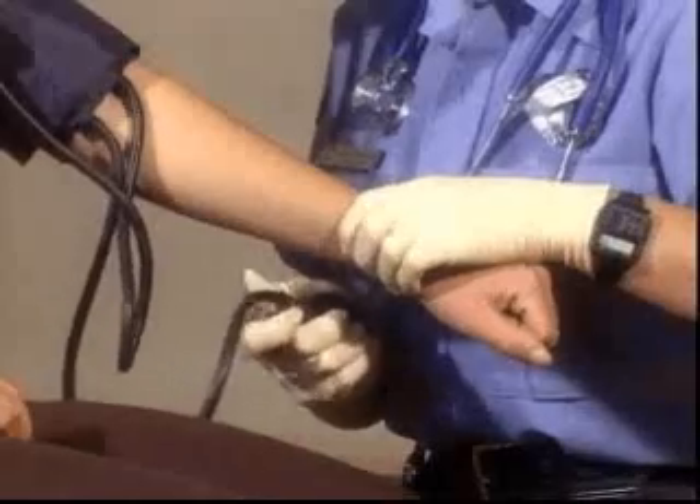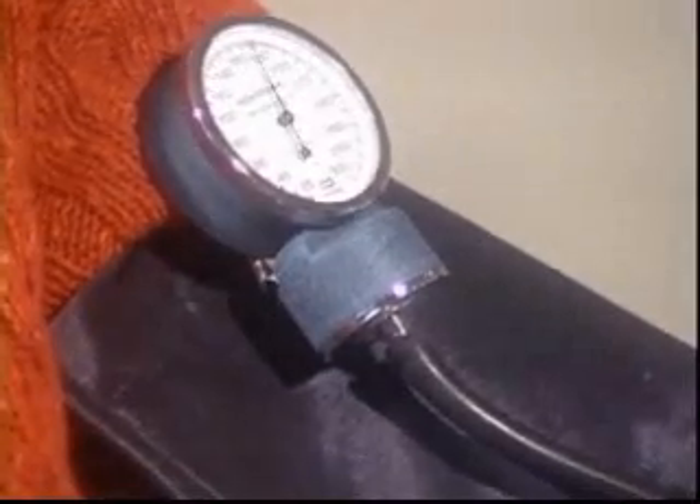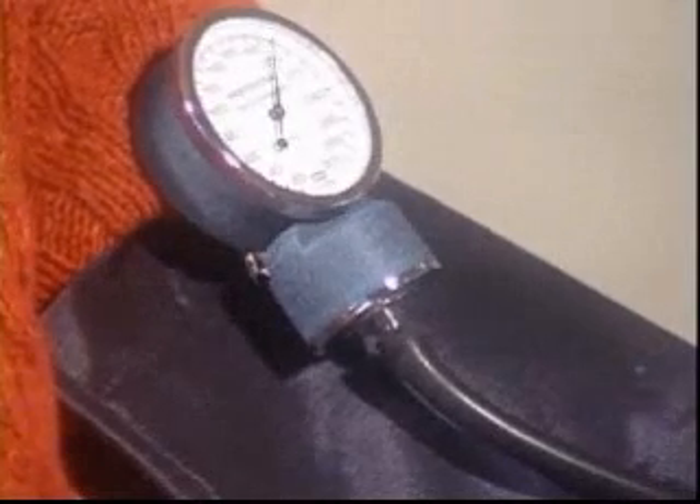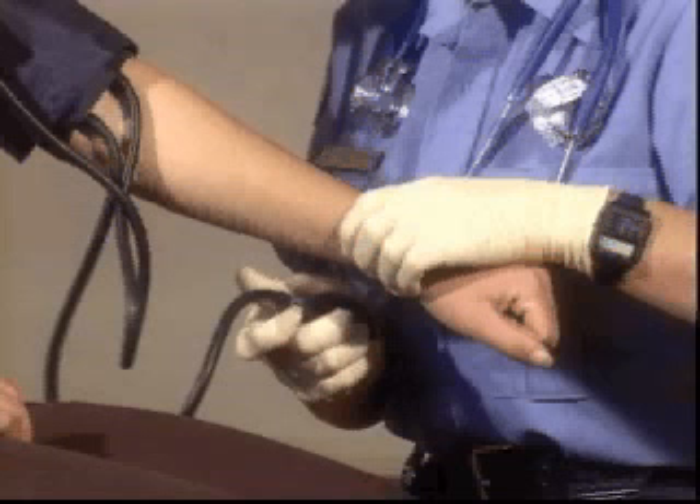Now, squeeze the bulb to inflate the cuff until the pulse can no longer be felt. The pressure in the cuff matches the pressure needed to close the vessel and to stop the flow of blood. Keep inflating for about 30 millimeters of mercury above the point where no pulse is felt.